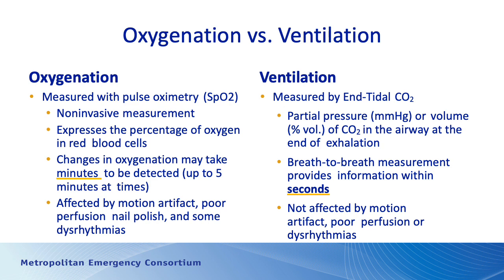So if you have a patient who's breathing normally, then you give them a big dose of narcotic and Versed and interfere with respirations, you can see immediately the change in respirations by watching the waveforms. The waveforms will get longer and they'll have fewer respirations. Generally, capnography does not have as many problems with dysrhythmias, artifact, and so on. Motion is generally not an issue as long as the sensor is in place in the nose or in line on the endotracheal tube.